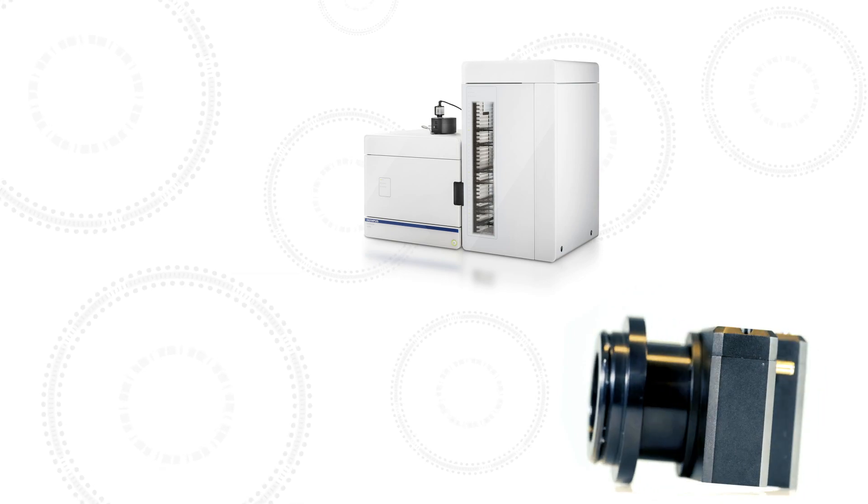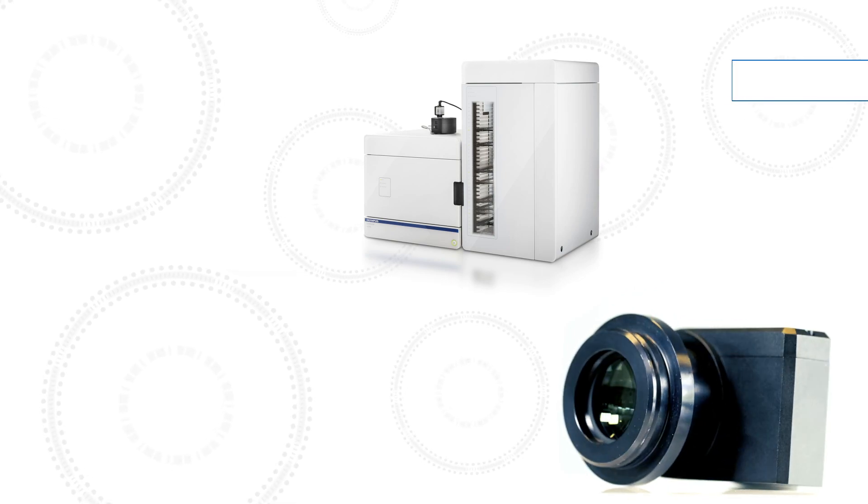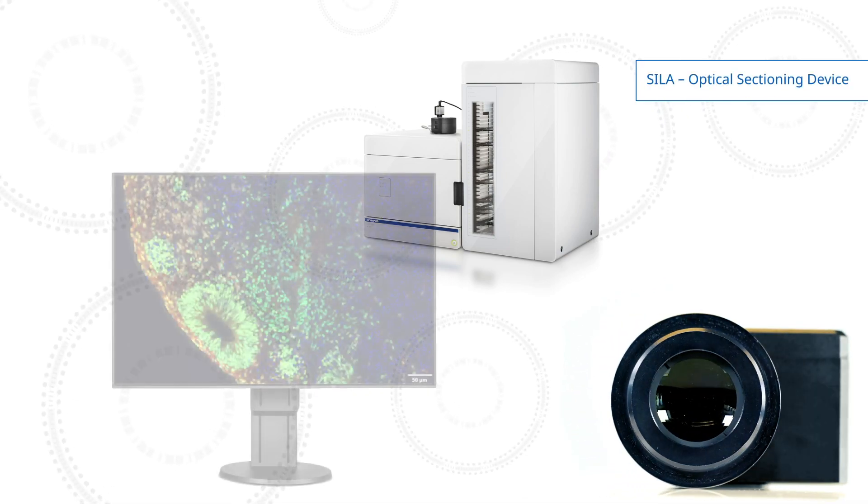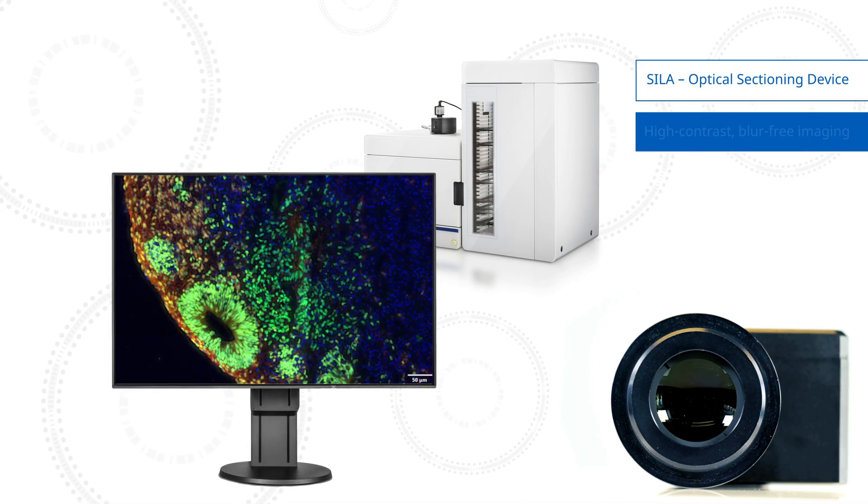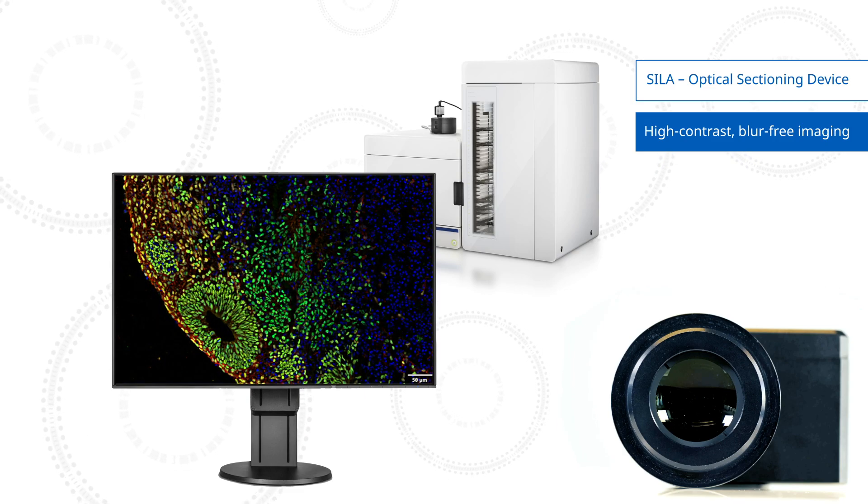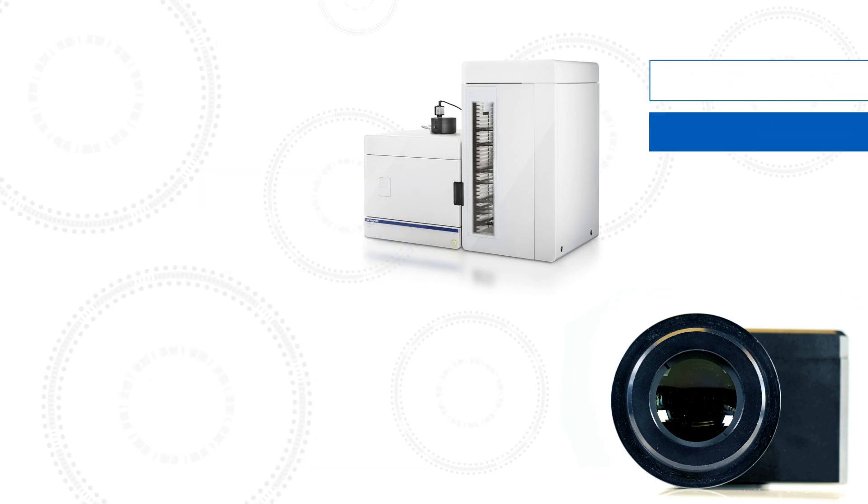The VS-200 Slide Scanner's SILA Optical Sectioning Device brings high-contrast, blur-free imaging to your VS-200 system.